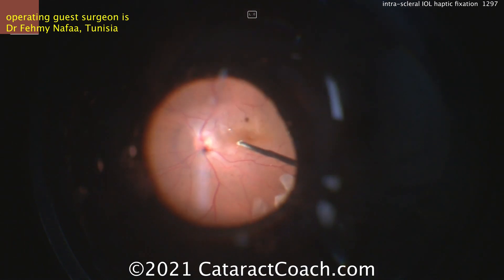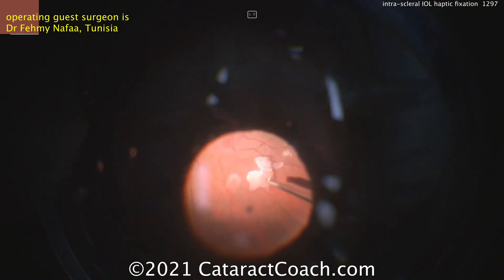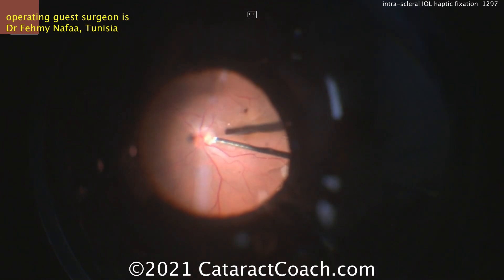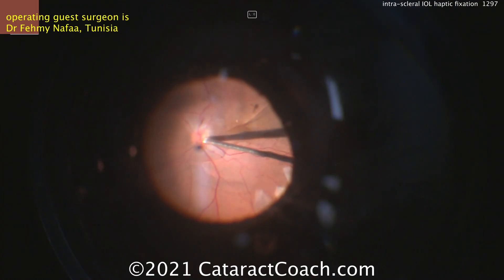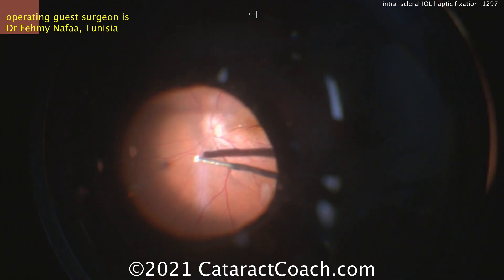It's important to make sure that you have a nice, healthy retina and you didn't cause any breaks. You can see there's a little bit of lens material that can be removed with a vitrector. And there — a PVD and completing the pars plana vitrectomy.